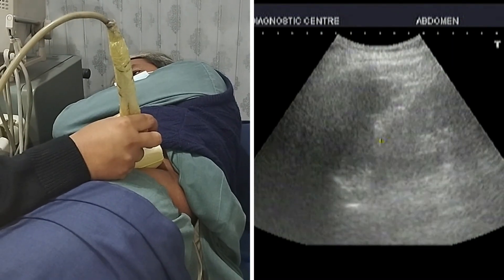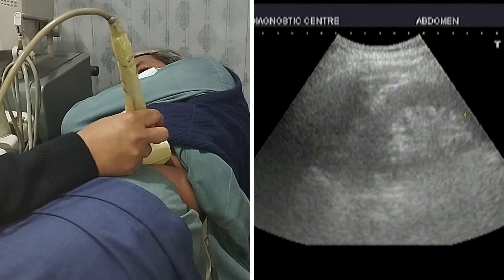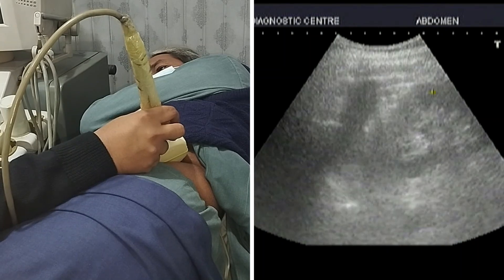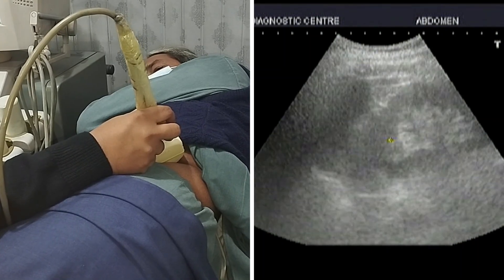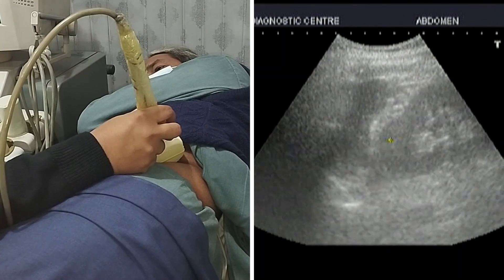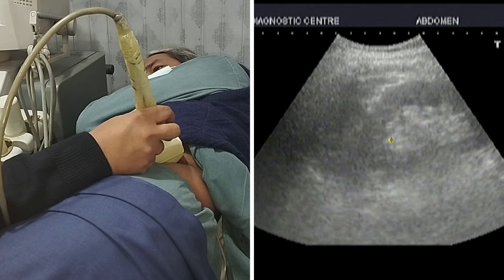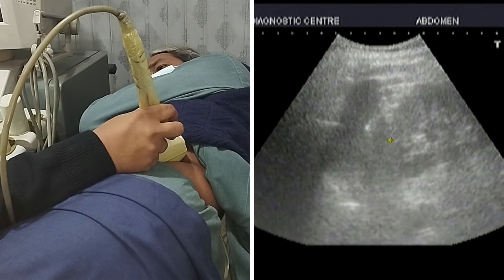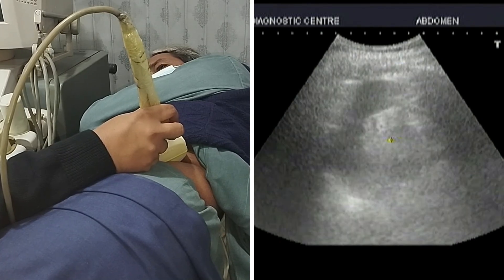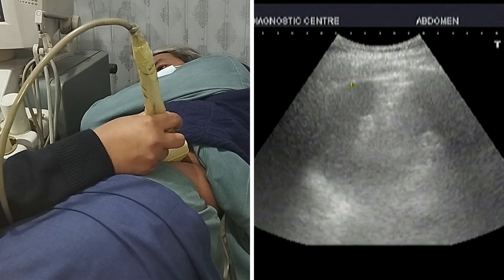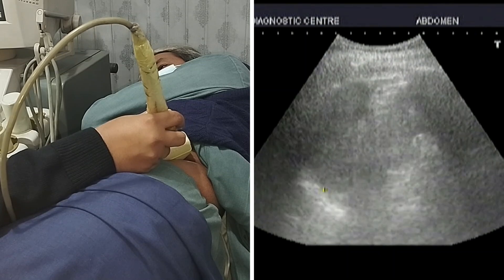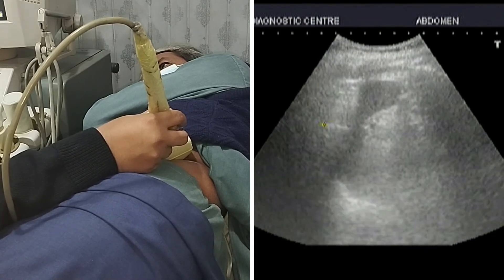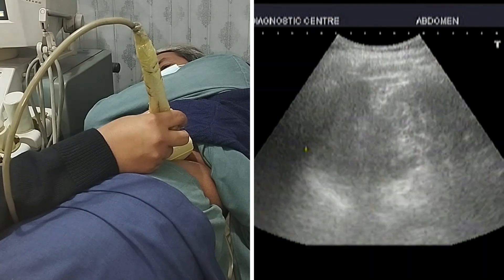I will put my probe in the mid-axillary line just below the rib cage. Here I have put my probe and this is the left kidney, which is easily and immediately visible under my probe. When I focus the left kidney, I will tilt my probe a little bit downward — and this is the spleen. This semi-lunar structure visible on the screen is the spleen.